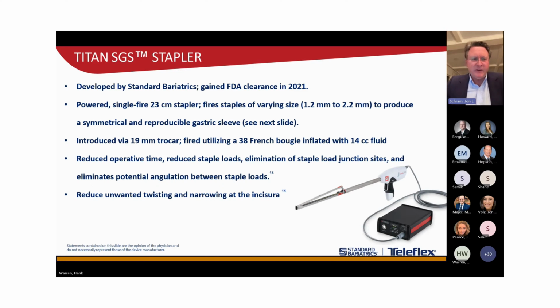Well, I think that's a really nice video because it demonstrates in a very short time a lot of the things that we're going to be talking about tonight. It would be remiss to just say that the Titan SGS stapler was developed and gained clearance by the FDA in 2021, because the development of this stapler really goes back nearly a decade, when John Thompson in Cincinnati first envisioned an anatomy-based approach to the sleeve gastrectomy. Then, working with some incredible engineers from Ethicon, he began to develop the concept, first the clamp, and then finally the product that you see in front of you right now.